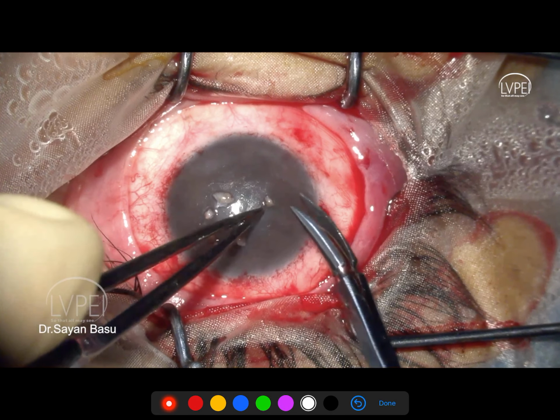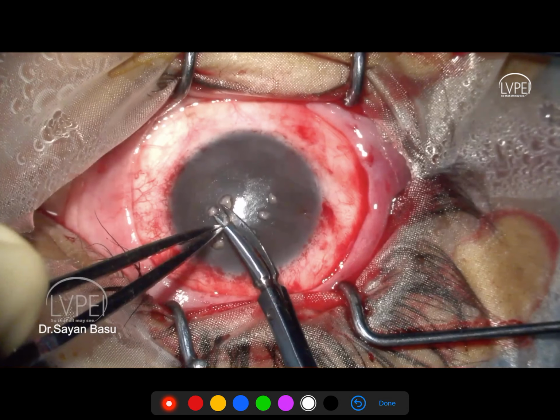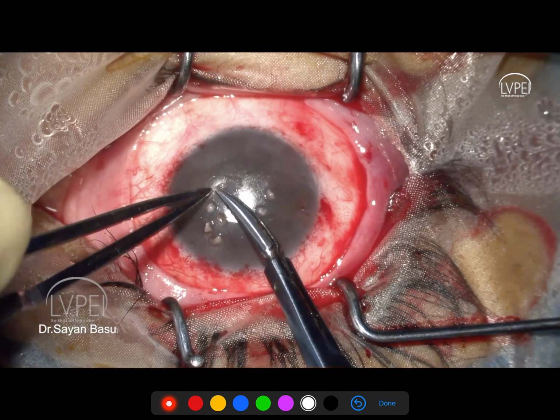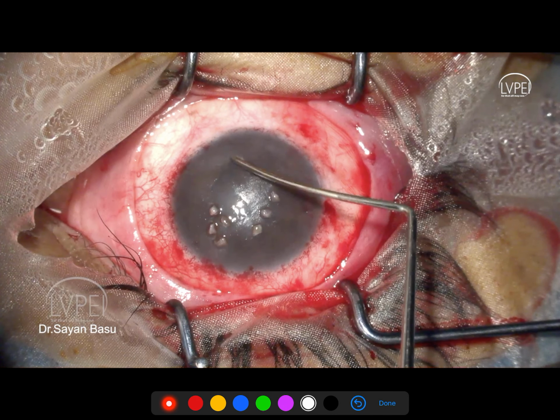So once I have cut the pieces to the shape, and I am typically trying to get triangular shapes, but in the beginning when you are cutting these tissues, it doesn't really matter what shape. In a tissue that is about 3 to 4 millimeters in length, or 1 clock hour in length, that tissue we typically will divide into 6 to 8 parts. So 1, 2, 3, 4, 5, 6, 7, 8. That's the ideal number of shapes that you want.